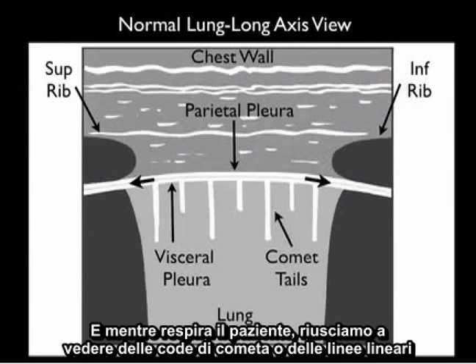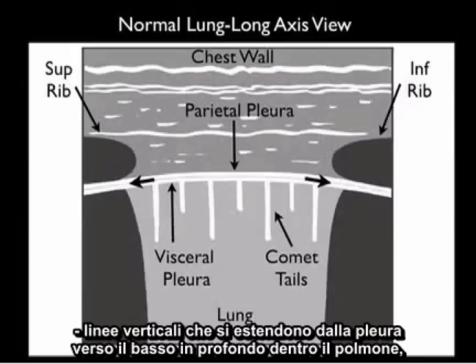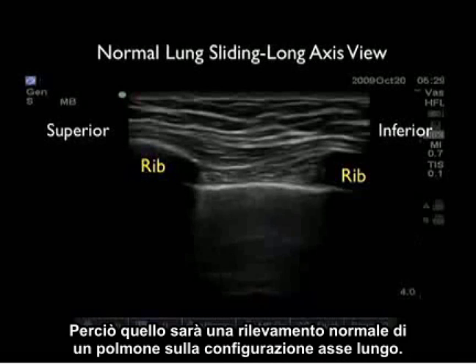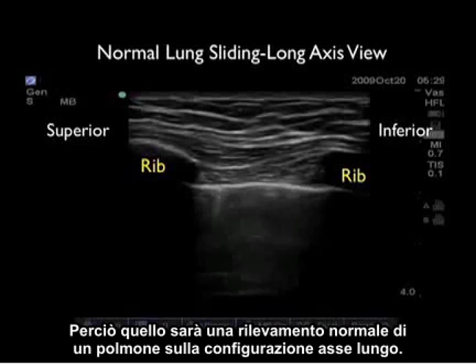As the patient breathes, we can see white comet tails — vertical lines — coming off the pleura down deep into the lung. That will be the normal finding of a lung on long axis configuration.